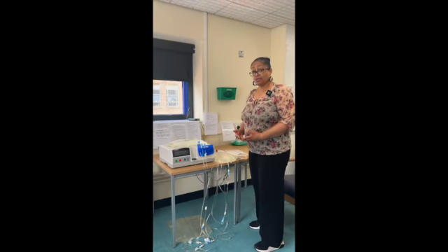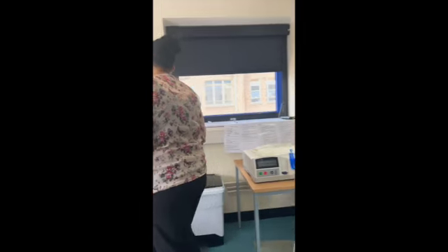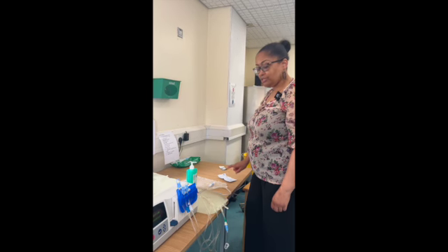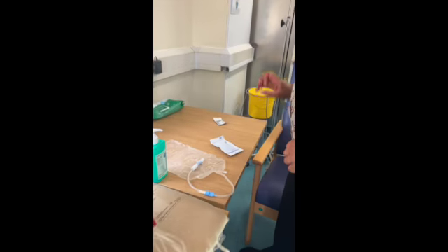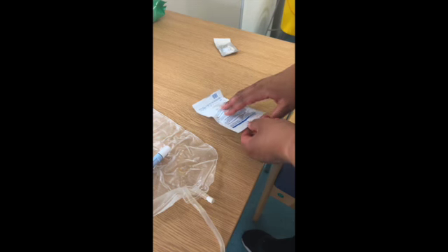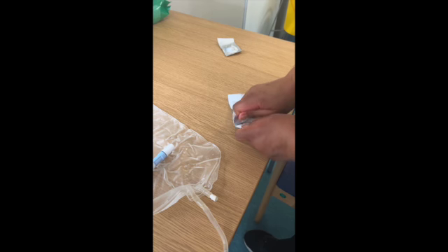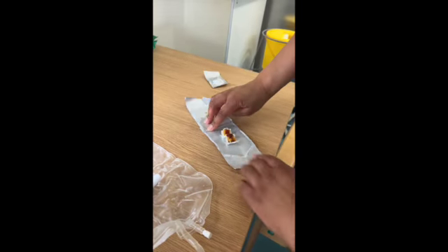Before I connect, I'm going to do a 2-minute hand wash. So now I'm going to connect the shield to the patient line. Now I have to open this really carefully so I don't touch the shield and contaminate it. There's an arrow there to show how to open it, and it's best to open it on a flat surface to make it easier. And then I'm going to crease that so it doesn't flap open.